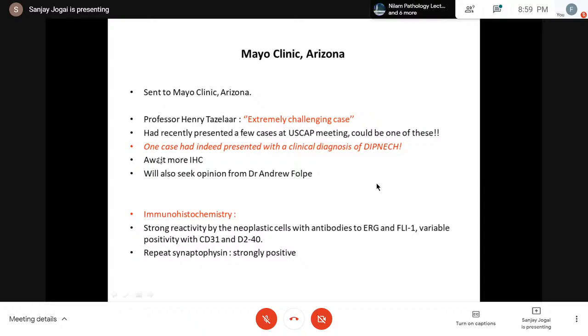And he said, I'll wait for more immunos, but he would also show it to Andrew Folpe, who is quite a well-known soft tissue pathologist. Now, what they got was strong reactivity with ERG and FLI1. We didn't have ERG at that time, we didn't have FLI1. And variable positivity with CD31 as well. And he also repeated synaptophysin, which was strongly positive. And what was this?